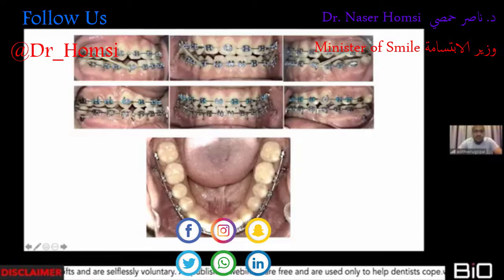And also the power chain usually gets into the gums. So to avoid that, I first start with this hook distal, and then later on, I engage it onto this hook. I divide the forces to 150 grams each, cumulatively getting onto about 300 grams per screw to the end.